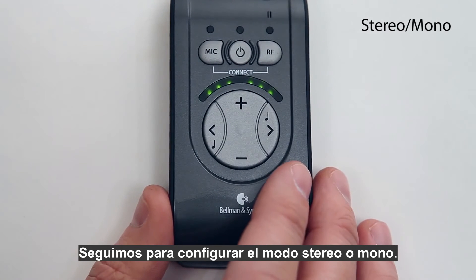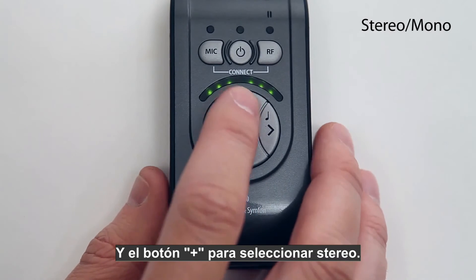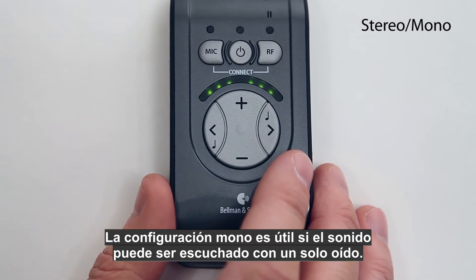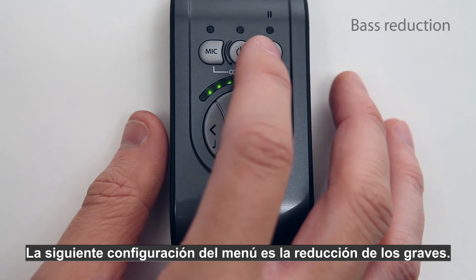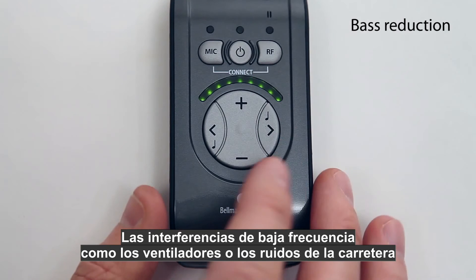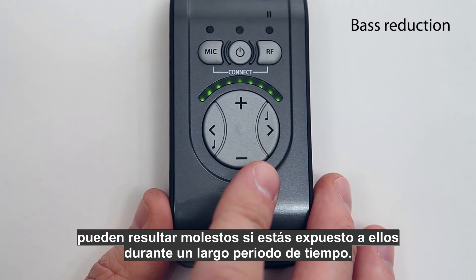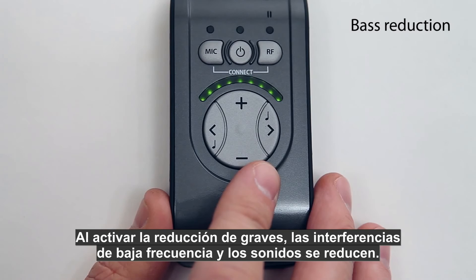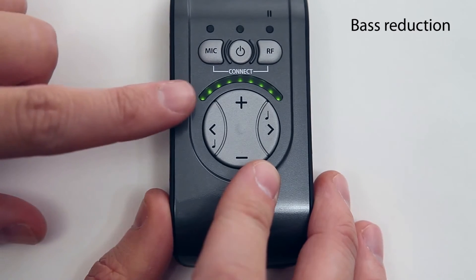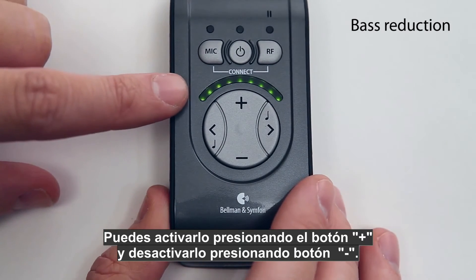Press the minus button to select mono and the plus button to select stereo. The mono setting is useful if sound can only be heard with one ear. The next menu selection is bass reduction — low frequency interference such as fans and road noise can be tiring if you are exposed to it for a long period. By activating bass reduction, these low frequency sounds are reduced. Activate it by pressing the plus button and deactivate it by pressing the minus button.